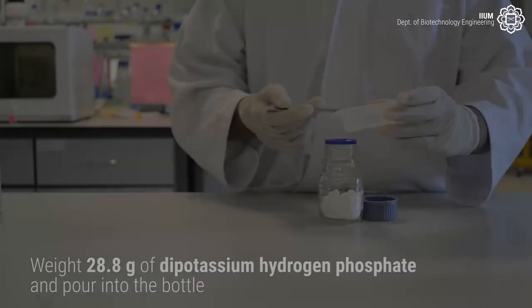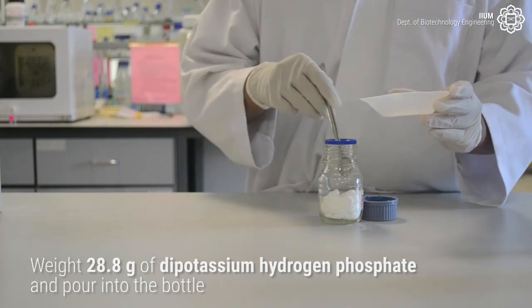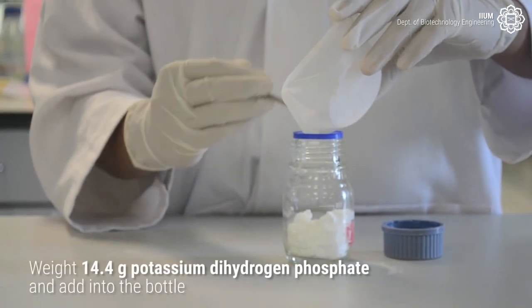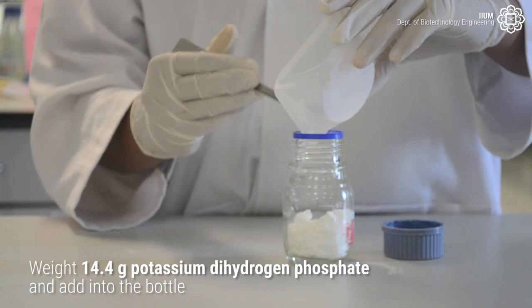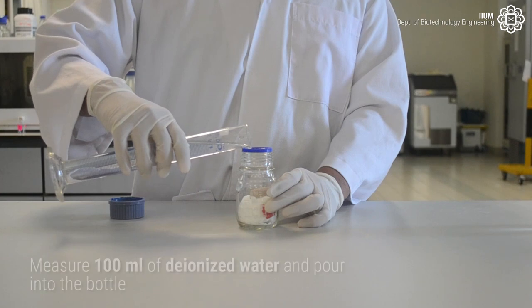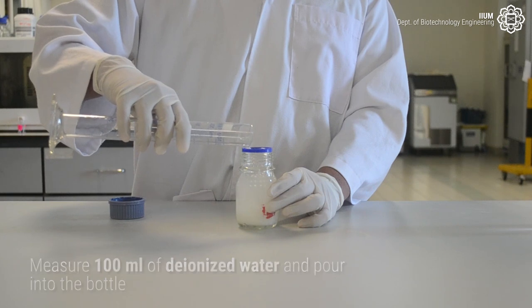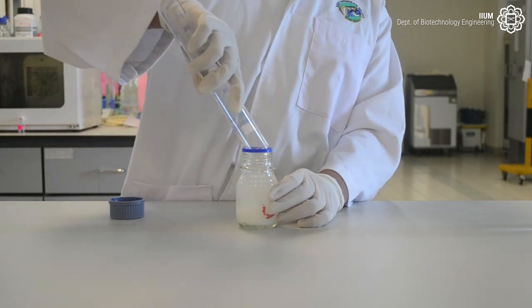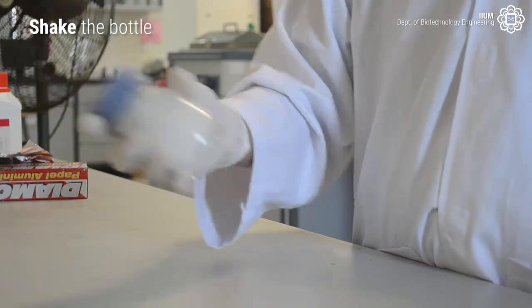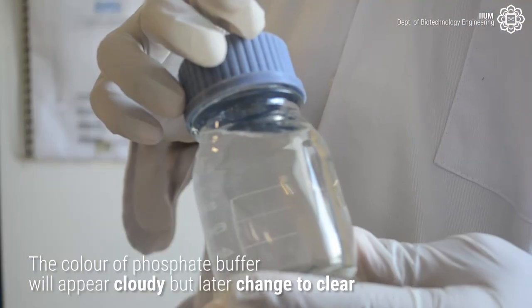First, weigh 28.8 grams of potassium hydrogen phosphate and pour into the bottle. Next, weigh 14.4 grams of potassium dihydrogen phosphate and add into the bottle. Measure 100ml of deionized water and pour into the bottle. Then shake the bottle to mix all the compounds. The color of the phosphate buffer will appear cloudy, but later change to clear.